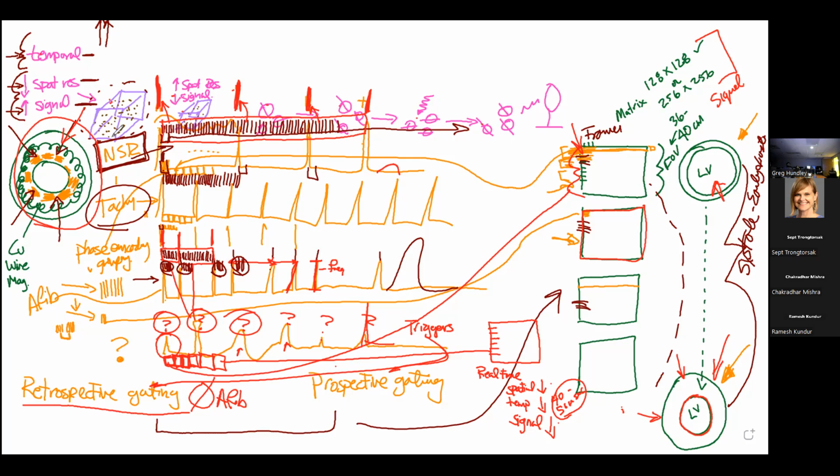Then we started off the conversation today. We asked someone who had a scan of their neck what was the first thing that the MR technologist asked them to do. Be still, okay? The whole technology assumes that nothing is moving. Here comes, oh my gosh, you're going to do cardiovascular examinations. Well, the heart is beating.